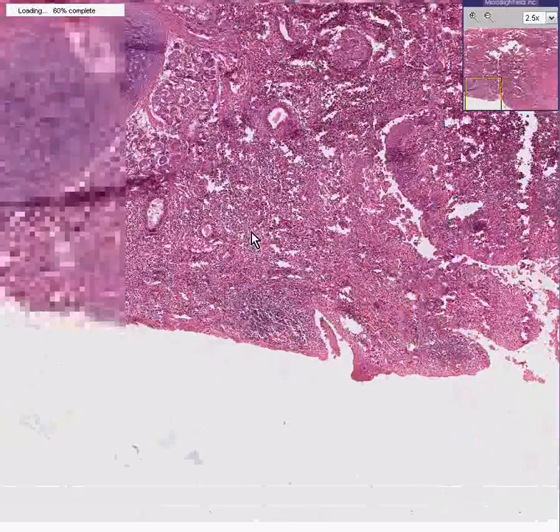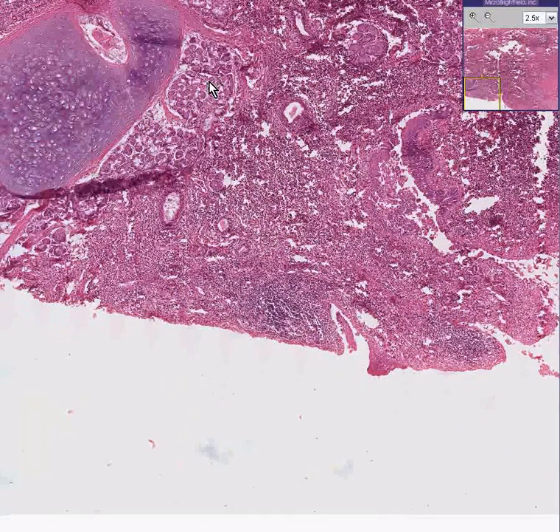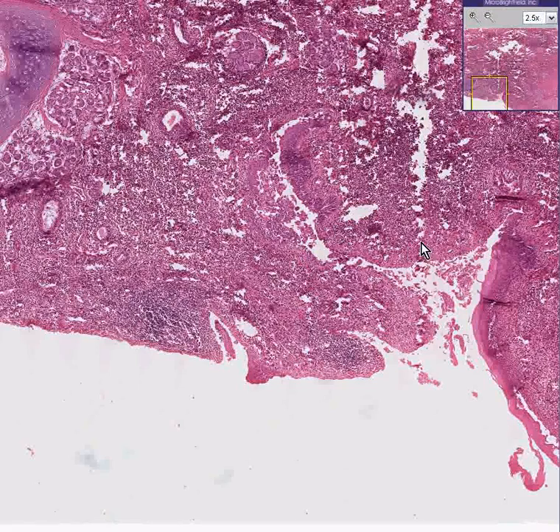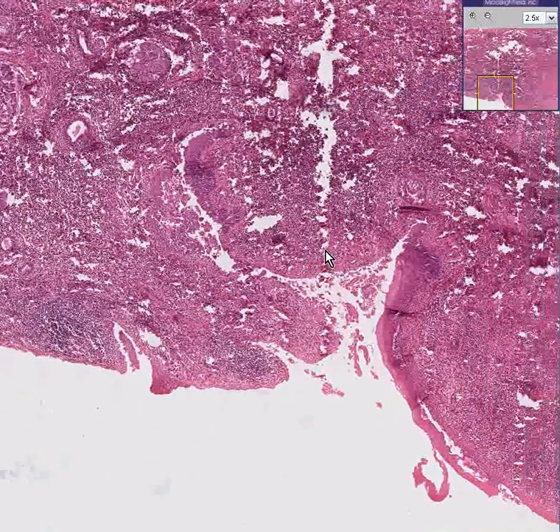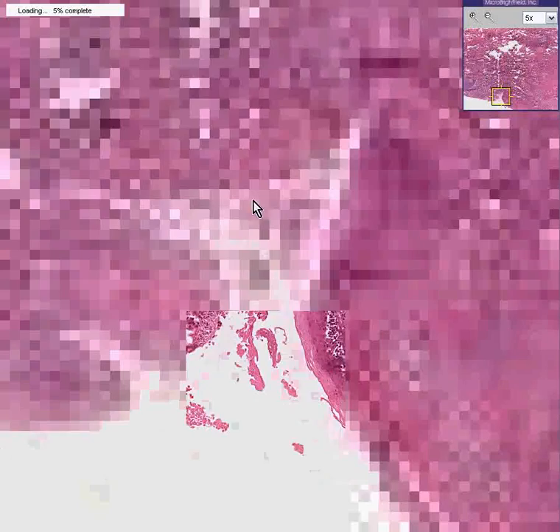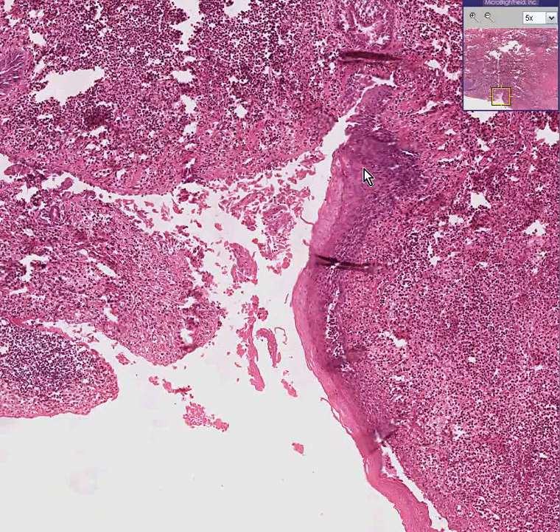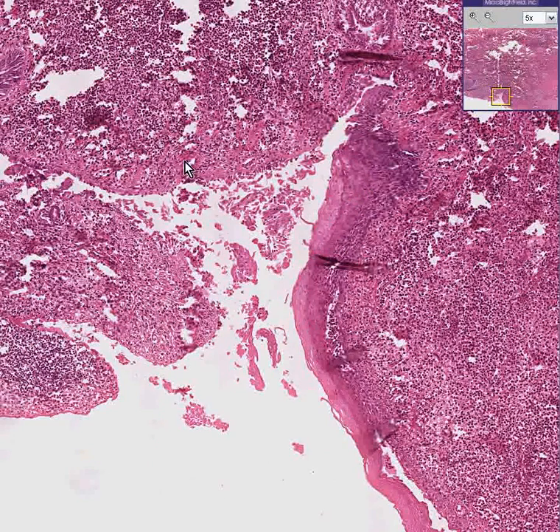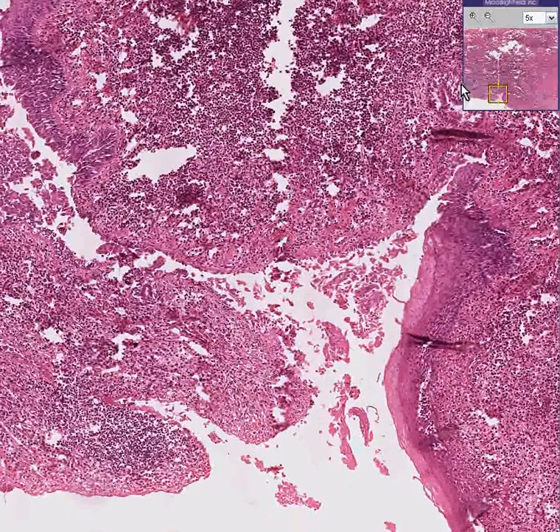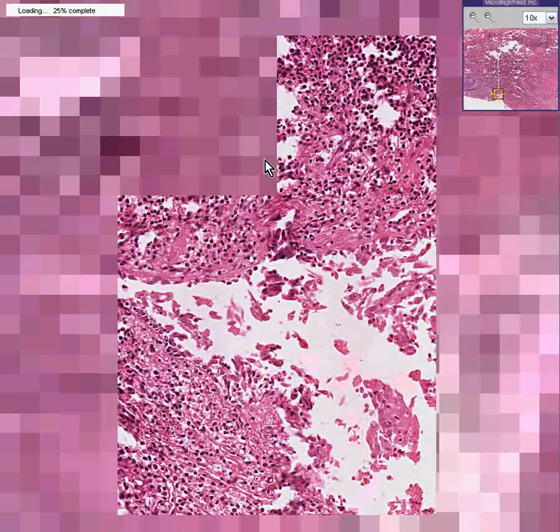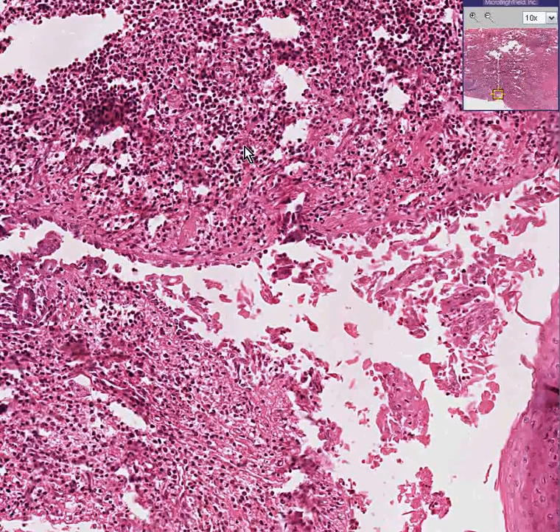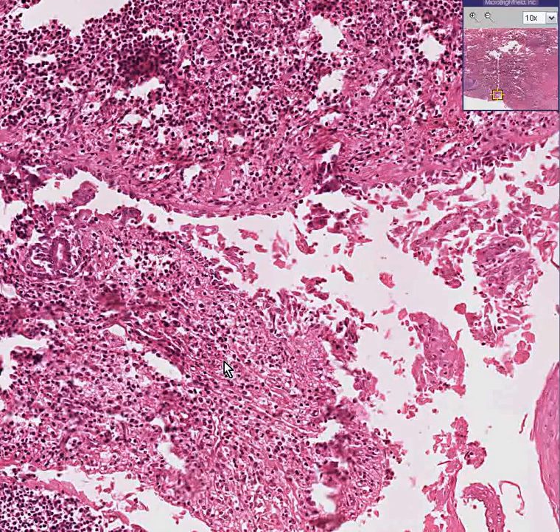Here is part of a laryngeal cartilage. Here are some submucosal glands. And here is the ulcerative, destructive process throughout the laryngeal mucosa, showing destruction and ulceration of the squamous mucosa — you can see a little strip of it over here — causing a huge amount of neutrophilic infiltrates and fibrin deposition. This is all neutrophils and fibrin in here.